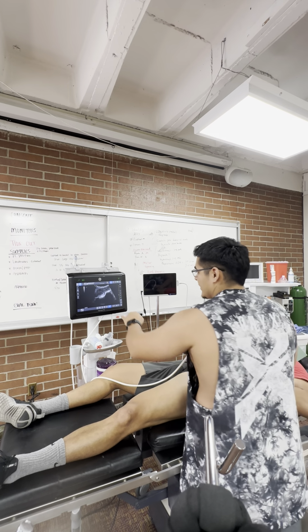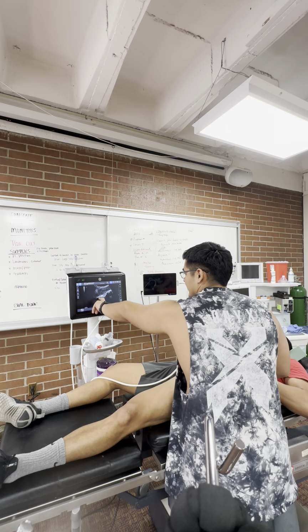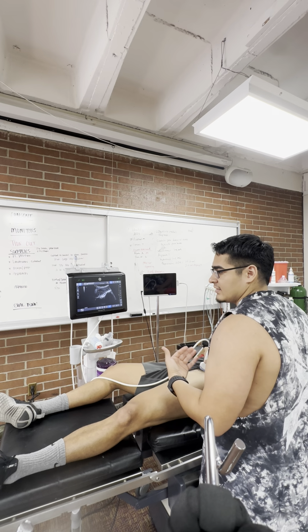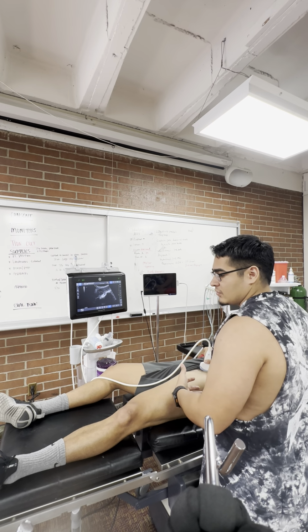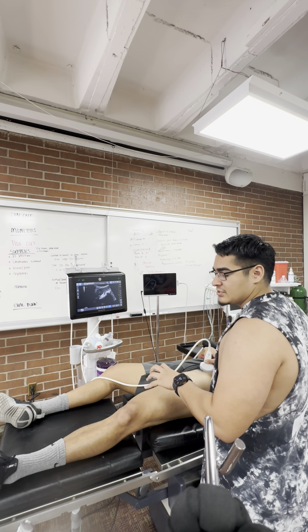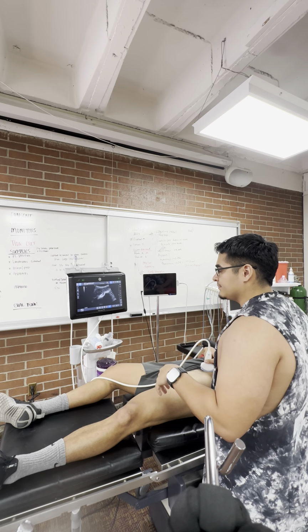And you should see the hydrodissection of the tendon coming off, and then you should also see the iliopsoas muscle also hydrodissecting. And the way you would test for this is you could place an ice pack on the leg, compare that to the leg that's not anesthetized, and they shouldn't be able to feel that cold sensation on the leg that we anesthetized, as well as they should have preserved quadricep function, so they should be able to bend the knee, they should be able to flex their quads.